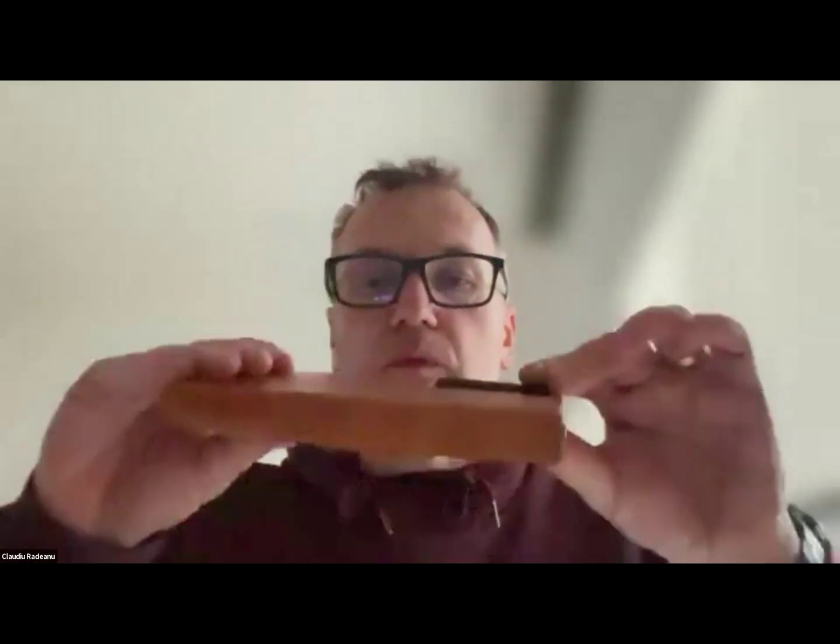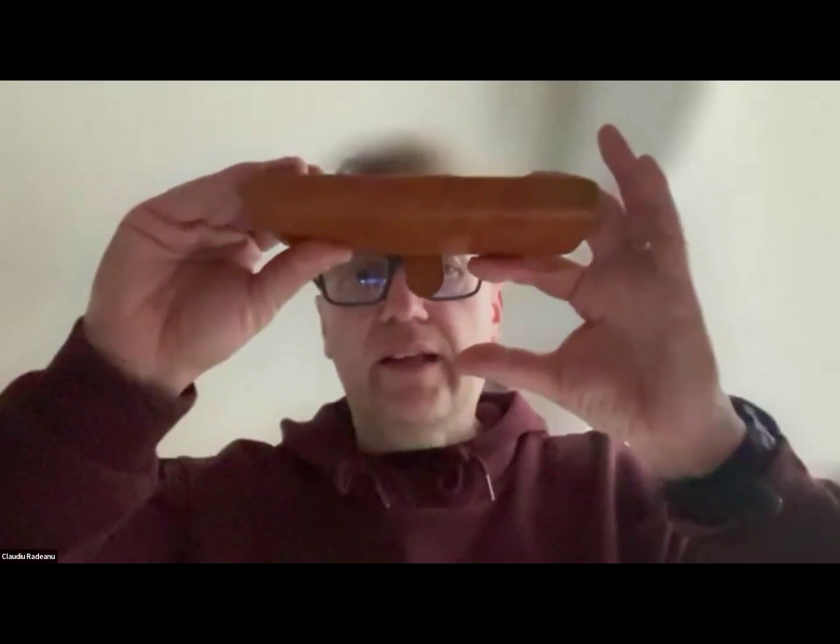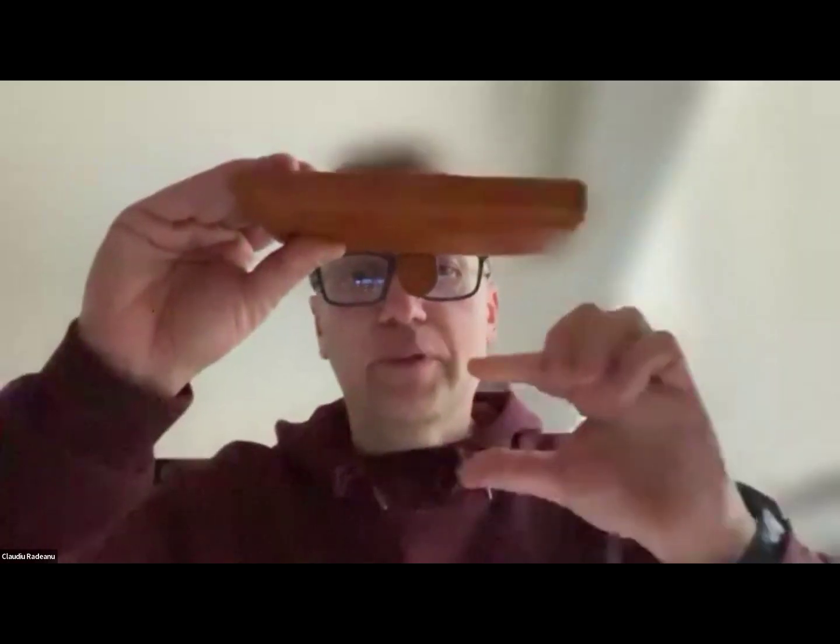Okay, if you're not sure, coming back, the distance is the same. So the pleura and the A line underneath it are the same distance as the thickness of the skin or the subcutaneous tissue. Make sense? So you have the pleura, and then underneath it you have an A line, and then another A line, but it's the same depth. They are parallel and at the same distance.